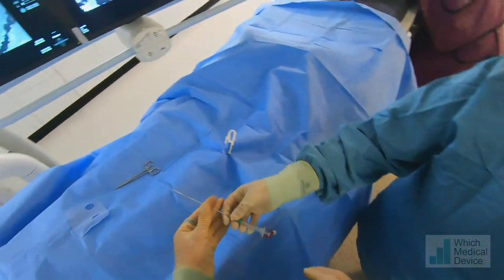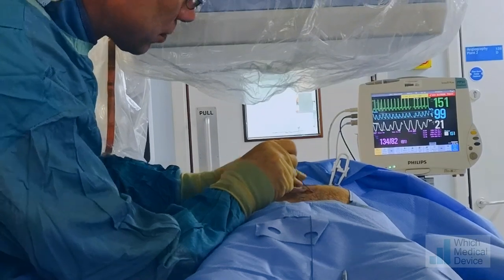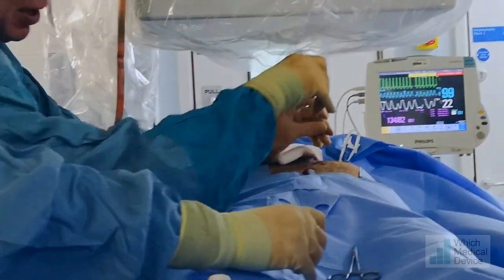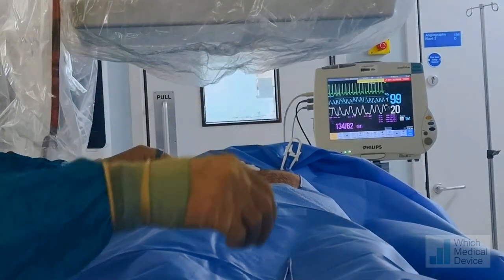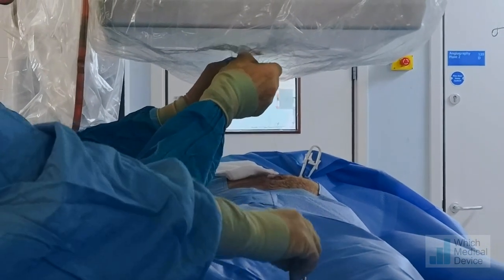Second T-fastener. Bit of pushing. We've got air back, so we're in. I'm going to advance the wire — that's deployed the T-fastener. Hold the stomach. We're going to slide this down.